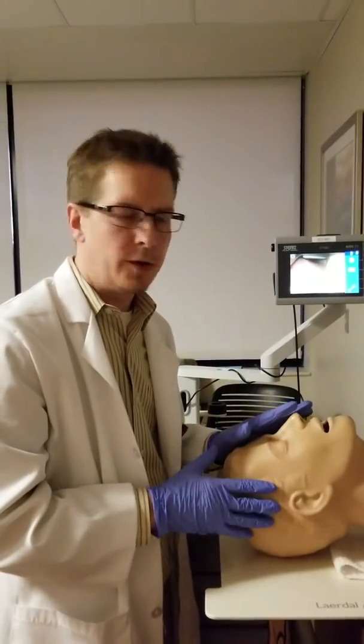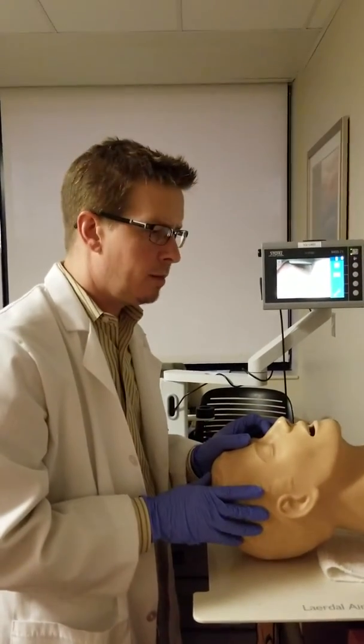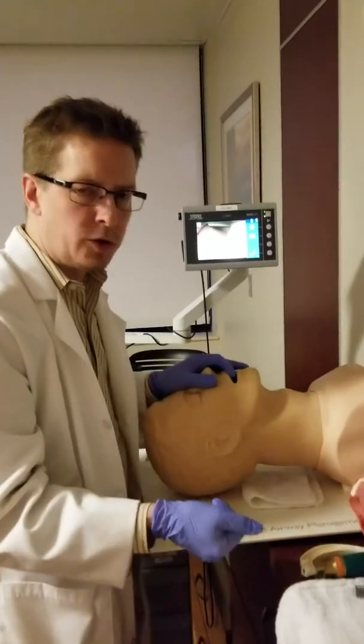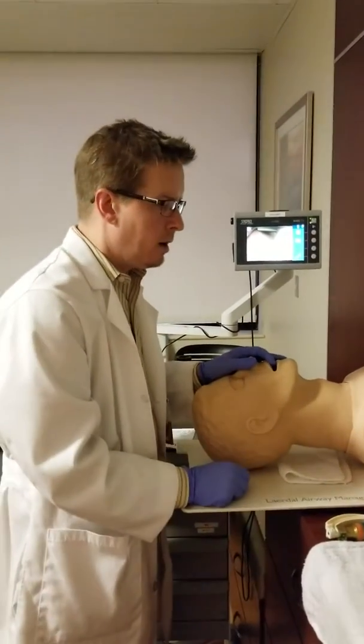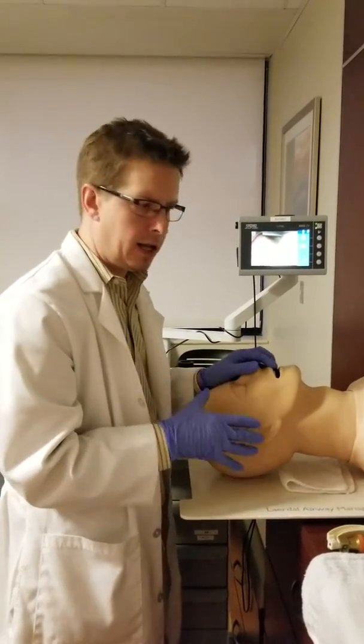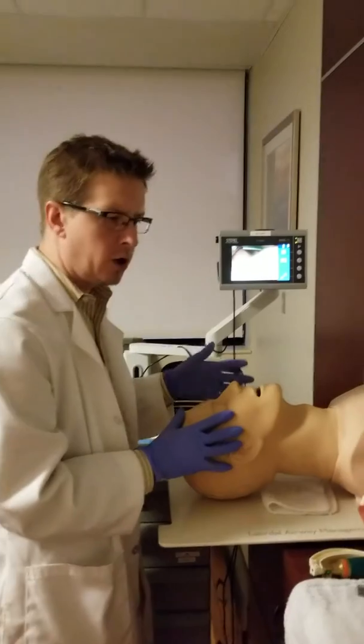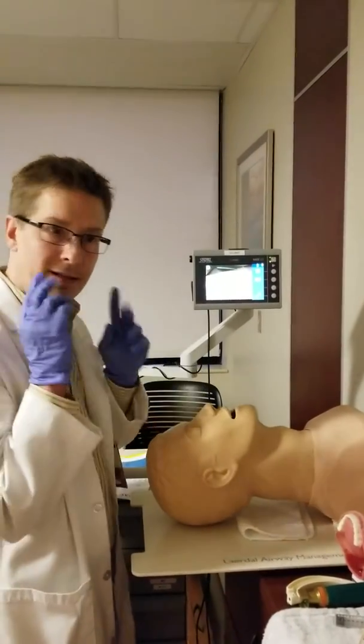All right, this is a quick little review on intubation. I'm not going to spend a whole lot of time on equipment as far as the endotracheal tube or what you'll need to intubate. This is more about the technique, and I'm using our CMAQ video laryngoscope so that you guys can see what I see.